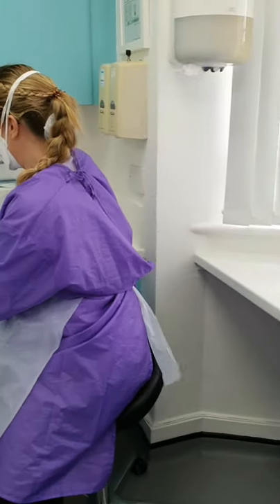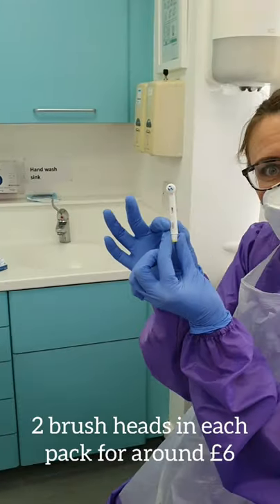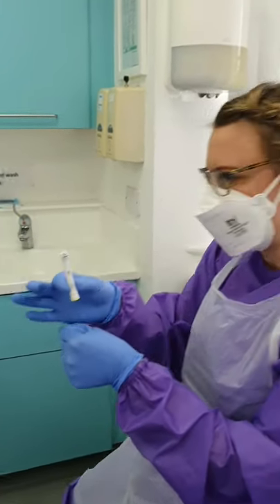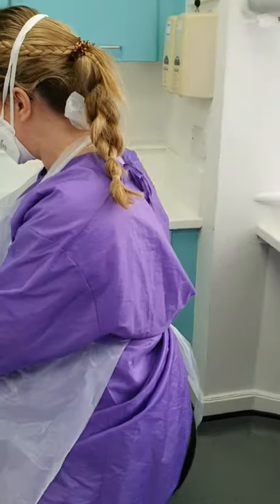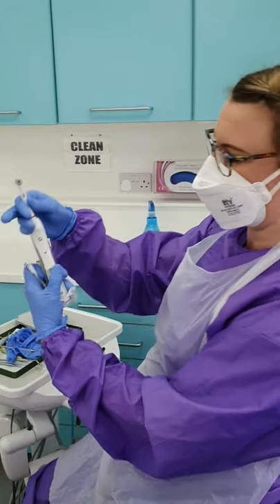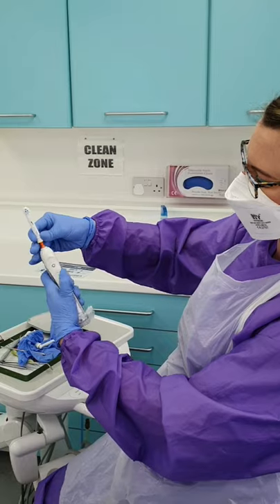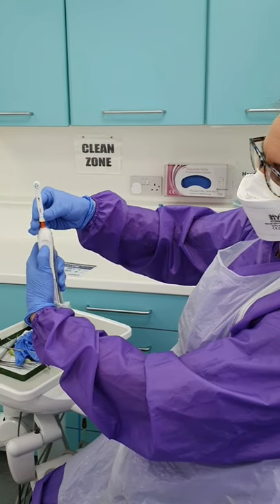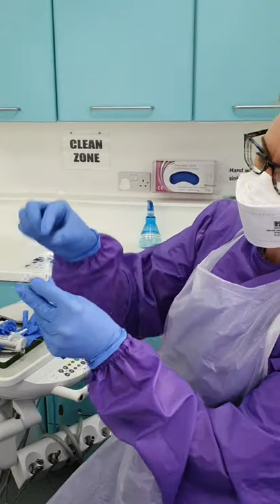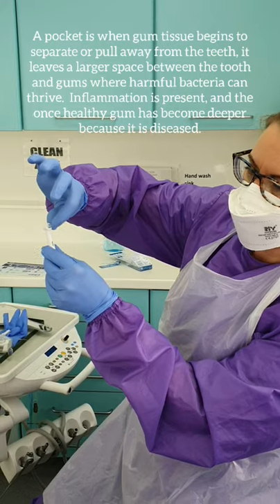So this is basically what it looks like and you get two of these in a pack. They fit on any Oralbee base. We can't really show on this one because this is a demo head, but the aim is that you take off your circular head and you pop on this little tufted gadget and it just basically vibrates like so. What you can also do to get into a deeper pocket is cut off these blue parts and just use the centre part.